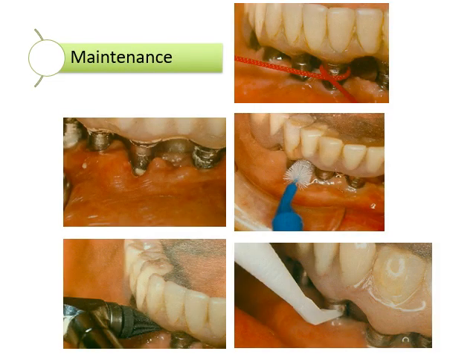This photo is showing us some different options that you can use to clean around the fixtures. If you notice in this first picture right here, there's some plaque buildup, some calculus buildup possibly. And we can get in there and clean that with a couple different tools. This up here is yarn in the upper right-hand corner. They're using yarn.